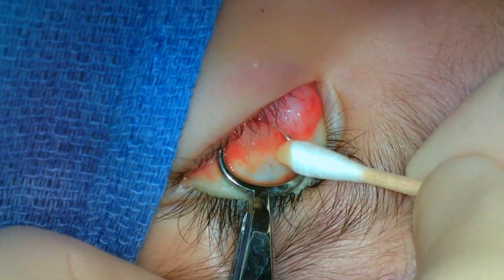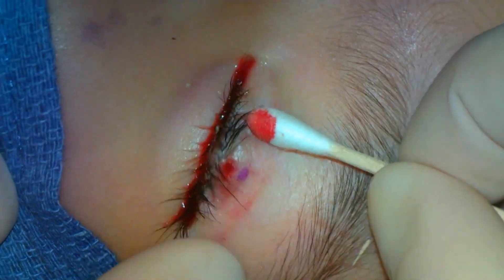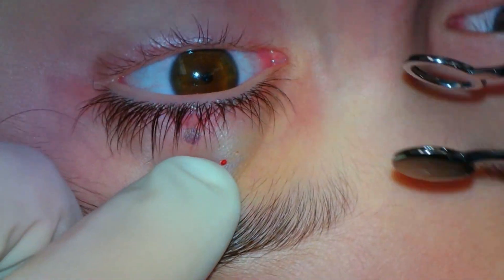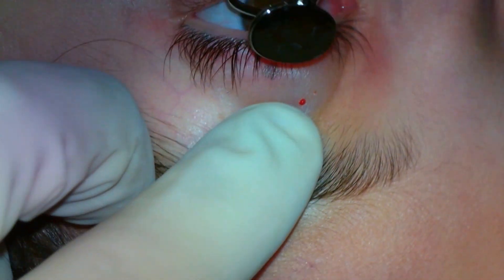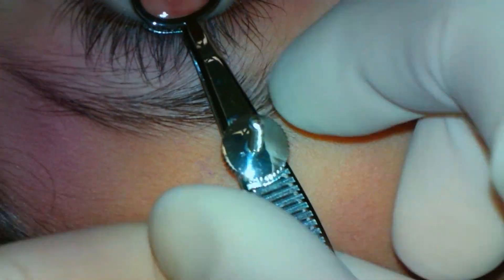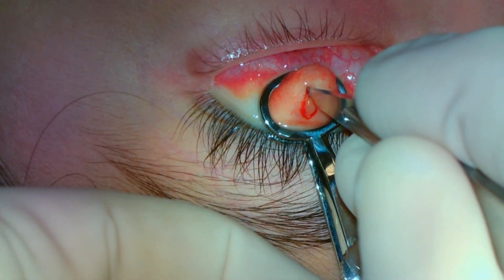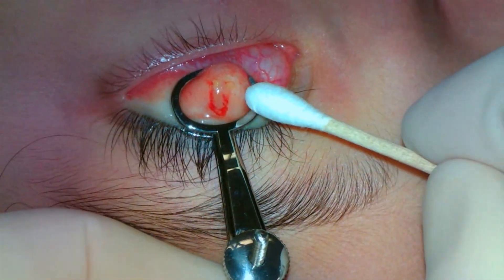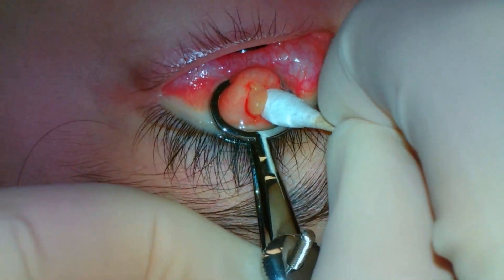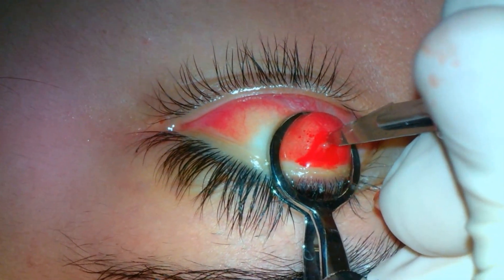The sixth lesion is on the upper eyelid. The clamp is placed, and you can see the expression of the thick abnormal contents of the adjacent meibomian glands. The 11 blade is used to make an incision and the contents of the lesion are removed. I think you need to be relatively aggressive in using the curette. I like to use a smaller curette rather than a larger one. It is not uncommon to compromise the overlying skin, which does not cause any problems.